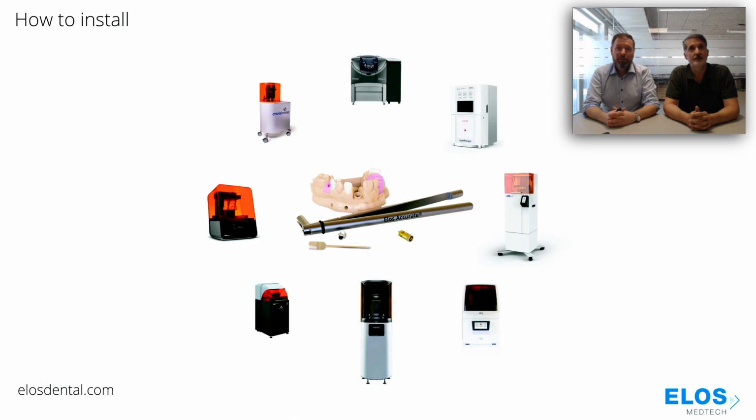What we also did back in 2018 is, with the PMA in mind and this new emerging technology with desktop printers coming out, during the development of the PMA, we actually sent prototypes of it to many of the large 3D print manufacturers. And they did a print test. They printed it on their setup to figure out the best settings in terms of layer thickness for the different materials that they had.